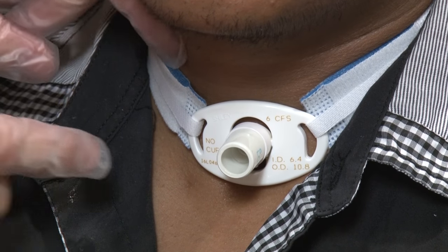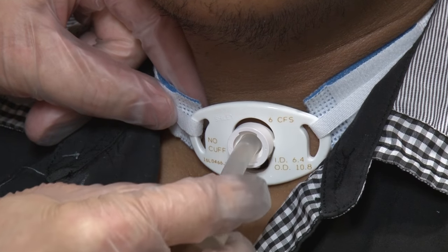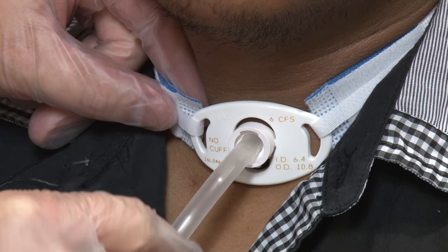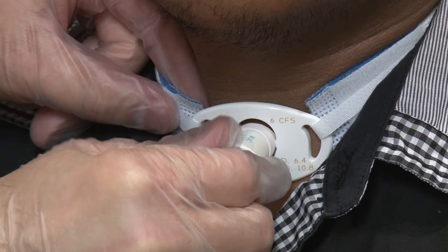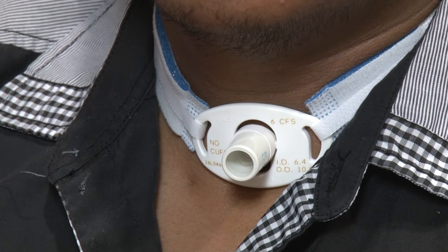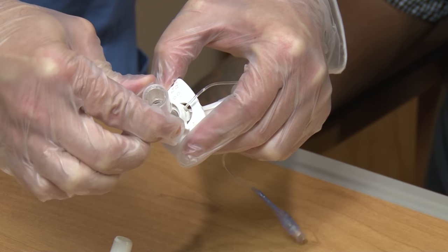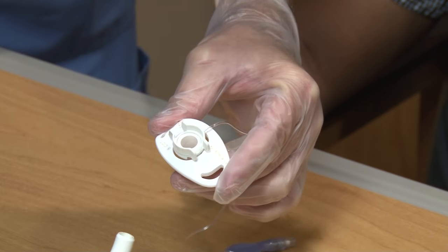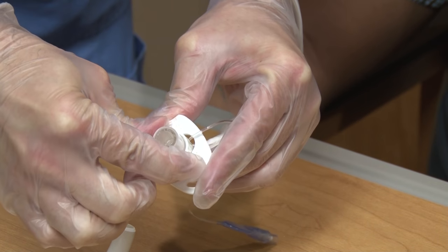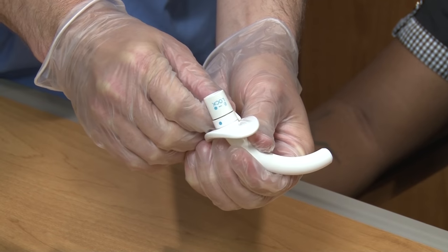The inside tube, called the inner cannula, is the part of the tracheostomy tube that should be taken out and changed or cleaned each day. Keep the inner cannula in place all day after you have cleaned it. Some inner cannulas have a clip lock connector, and others have a twist lock connector.